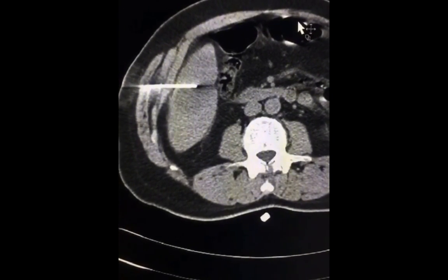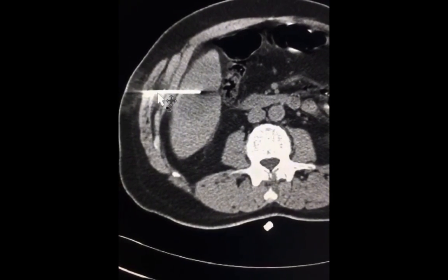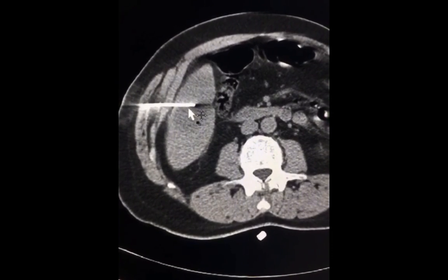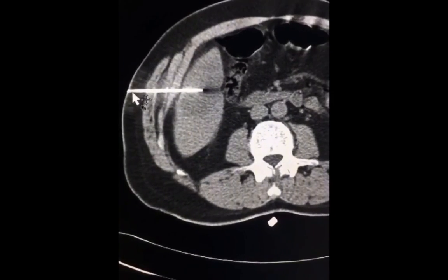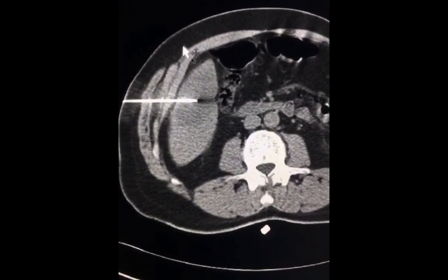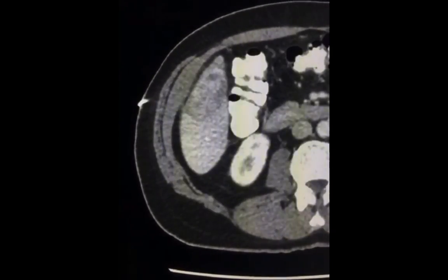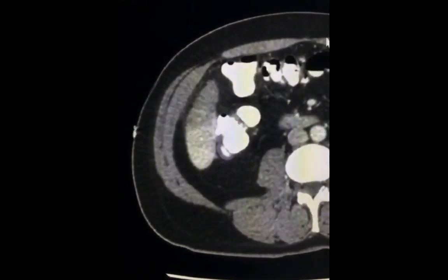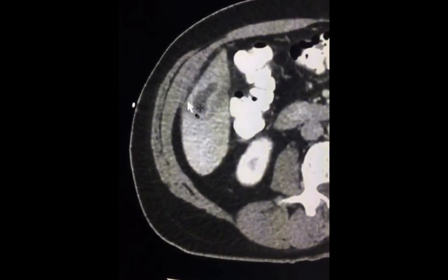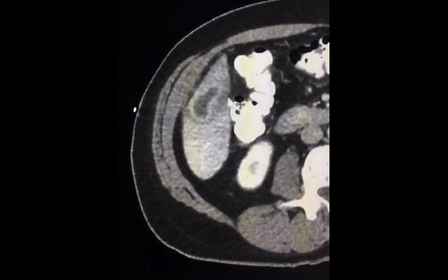When liver abscesses are sizable, the treatment is that of antibiotic with drainage. Percutaneous drainage is done here under CT guidance, and it could be done using ultrasound or even surgically. This is an image showing an introduction of the needle into the lesion using visualization under CT. This is a follow-up CT after drainage, showing a decrease in the size of the abscess. The image also shows the same feature that we saw before of surrounding hepatic hypodensity suggesting edema from inflammation.